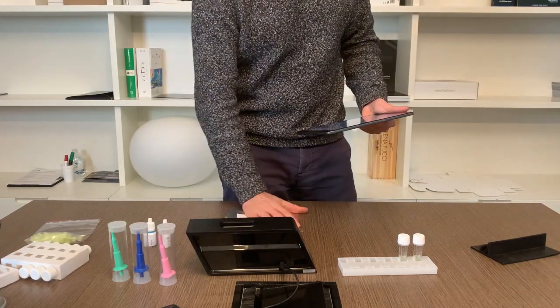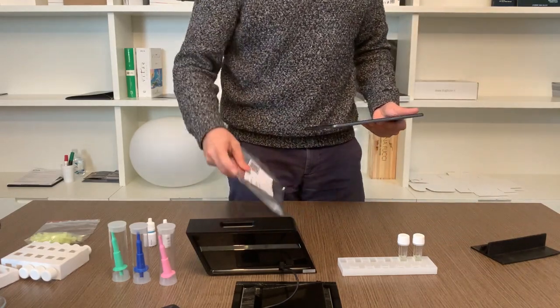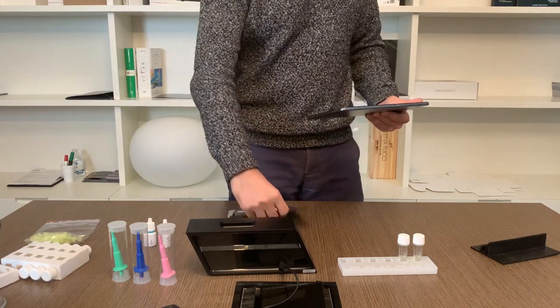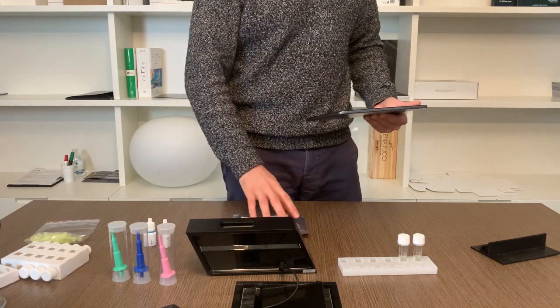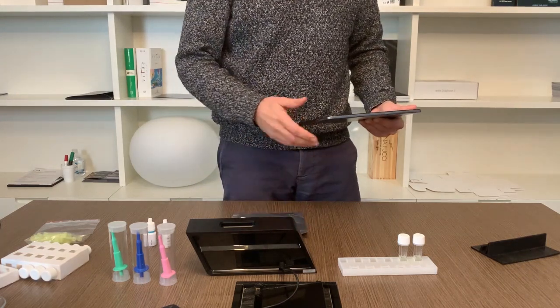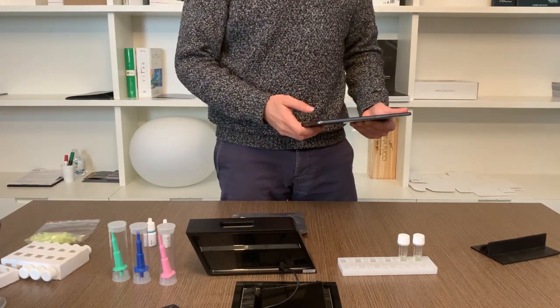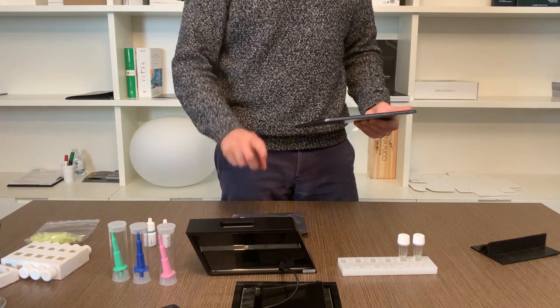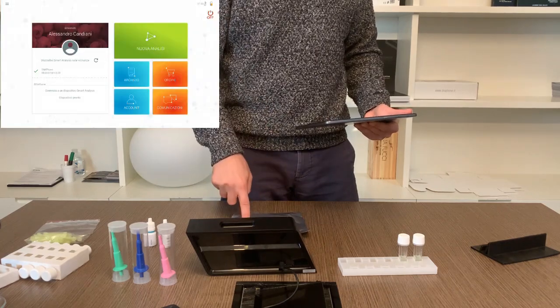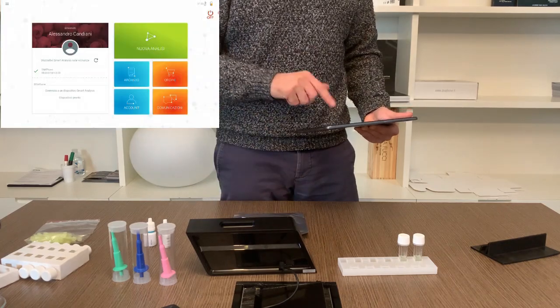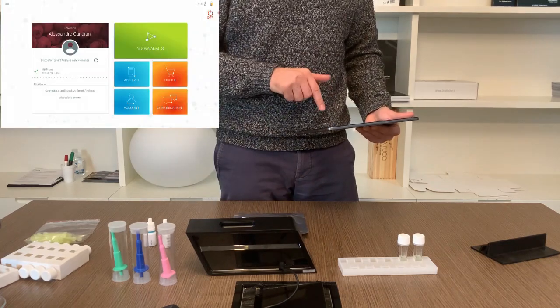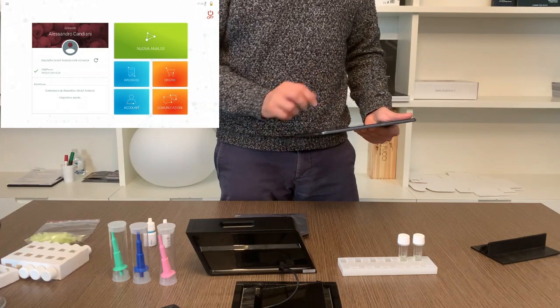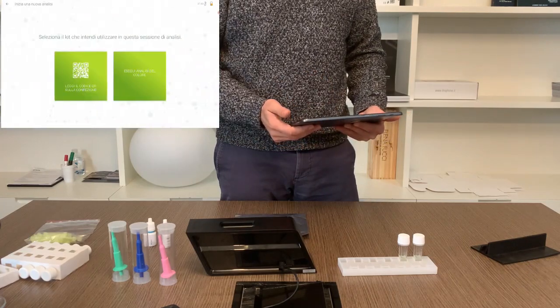Click on New Analysis to start the procedure and scan the QR code that is printed on each blister. This allows the application to start the guided procedure and to load all the data of the reagent batch that was used, in order to have full traceability.